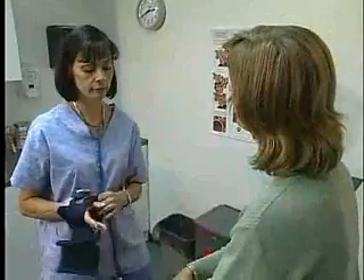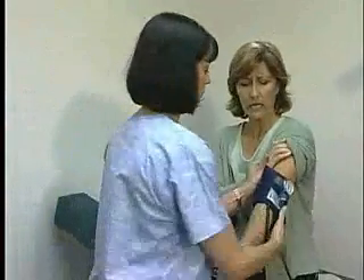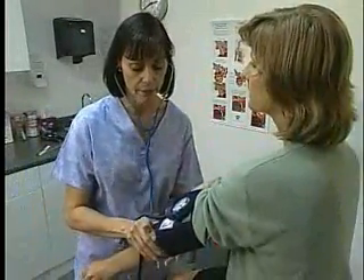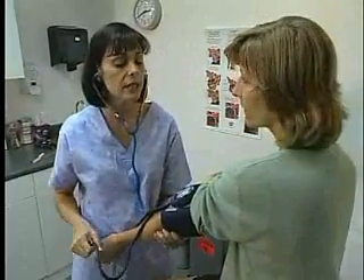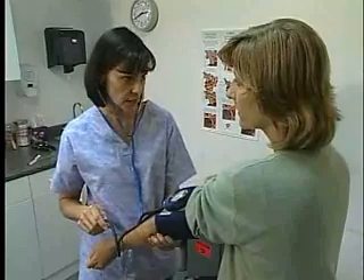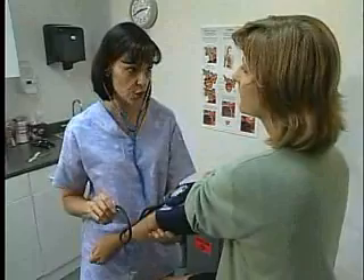So would you mind rolling up your sleeve? Sure — but take a little of the mystery out of this for me, because the doctor has told my husband to take his blood pressure every day. What is it that you're measuring, and how do you find it? Well, right now I'm looking for your artery to be able to hear your heart beating. This screw allows some air to escape from the valve. As the cuff deflates, I'll be listening to hear the first sound of your heart beating and note the pressure at which this occurs — that'll be your systolic pressure. Then I'll wait till I hear no sound at all — that's your diastolic pressure.